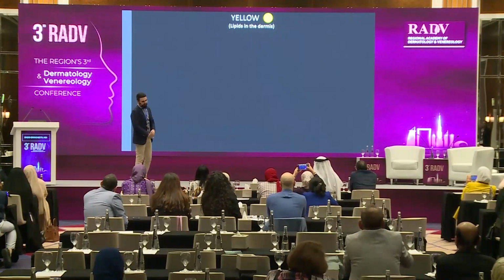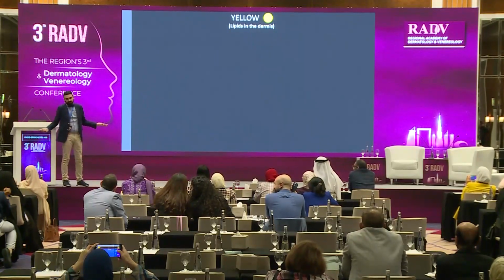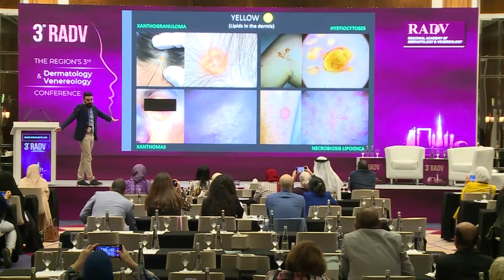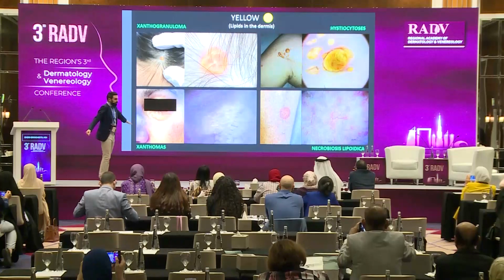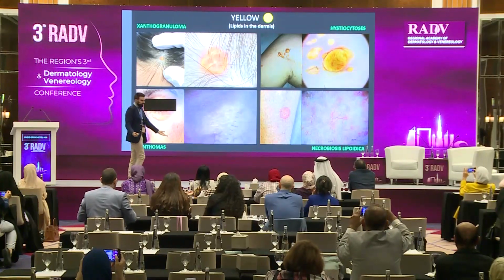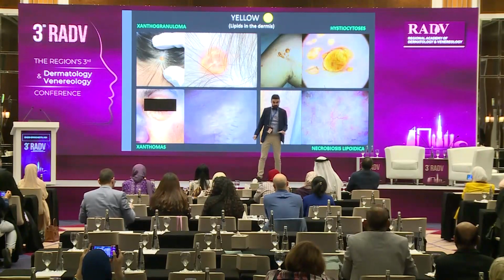So yellow, just very few words about yellow, because yellow is due to the presence of lipids in the dermis. So, which are the conditions? Xanthogranuloma, we have lipids. Histiocytosis, we have lipids. Xanthomas in general, we have lipids. Necrobiosis lipoidica, we have lipids, of course, associated with the vascular pattern I told you, and also orange areas, okay?